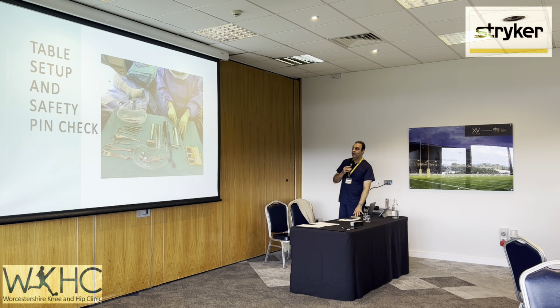We've got those. Now the setup is important, because what we found was that you've got to set up the tray. The tray has to be a reflection of your organization. So it's a bit like your kitchen at home. If you've got things everywhere, it means your kitchen is messy at home. If you've got everything neat and tidy, it means that you're neat and tidy at home. So we would suggest that you set things up like this.